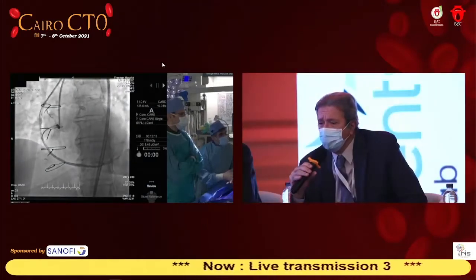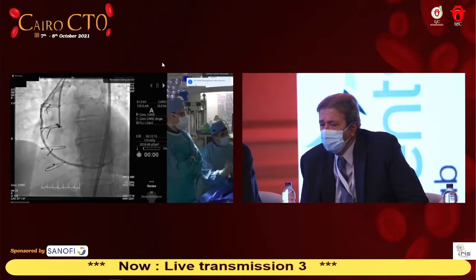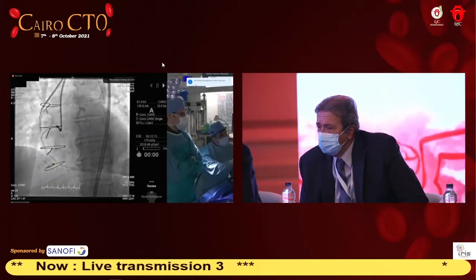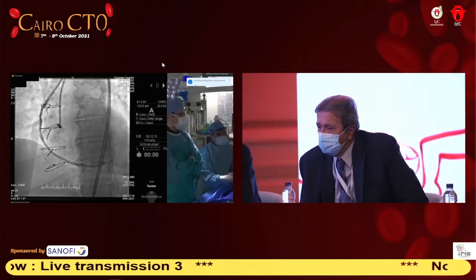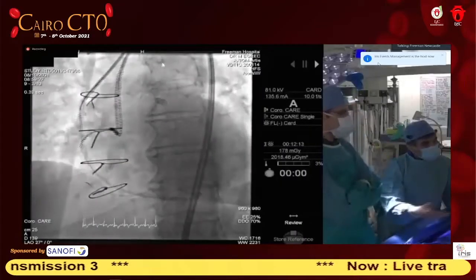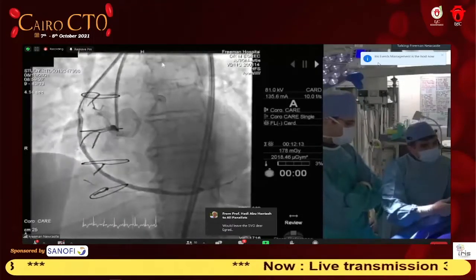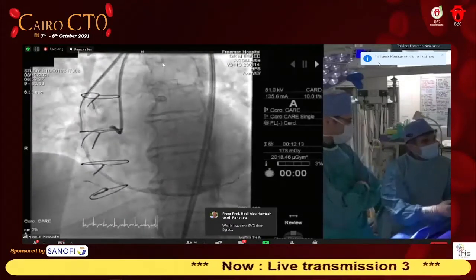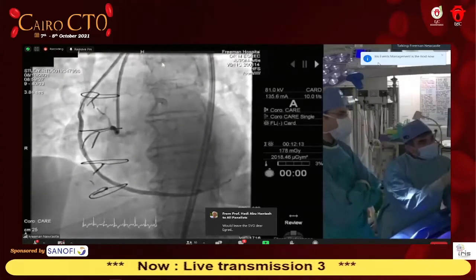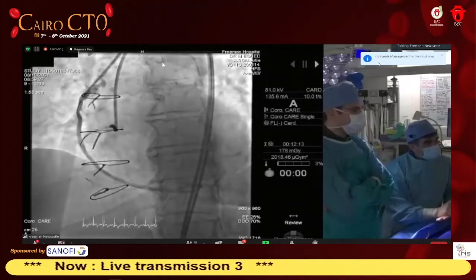What do you do? Yeah, I mean, to access the vein graft and the native artery, it's a soft wire, basically, because I could see where I need to go. Once I come to the body of the CTO, that's a different story. Then it becomes a wire escalation strategy. If I need to get a Confianza to pierce the distal cap, if I need to use a Fielder XT to knuckle back, and if I need to use different wires. And that's what I did in here. I took a Fielder FC here with the Corsair. We managed to navigate into the distal RCA.